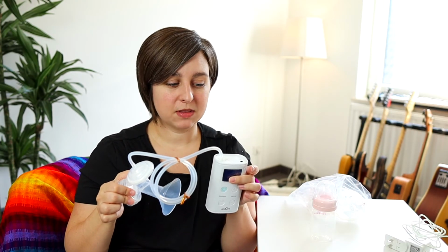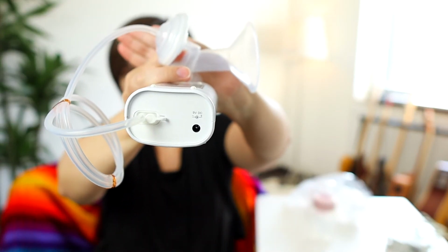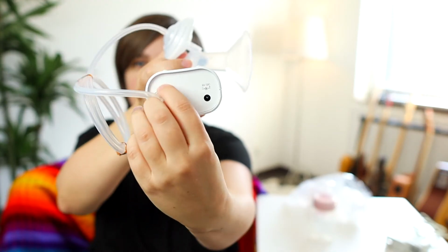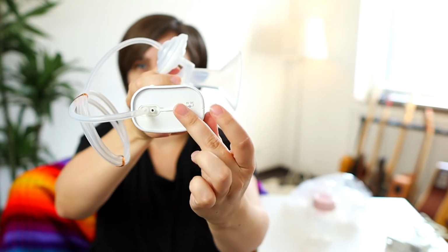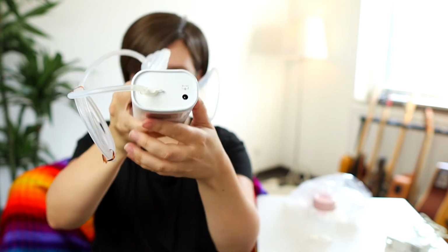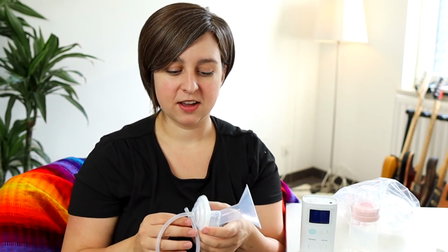Really standard setup there. I've got the valve closed here since I've only got one side hooked up to it. But if you want to do double pumping, you just put the other one on there. Single pumping, you close that. If you've ever used another breast pump, you'll have no problem figuring this out. Very, very standard. If you haven't, you can go and watch a more in-depth tutorial on how to set up a Spectra breast pump. I'll put a video up top for you.